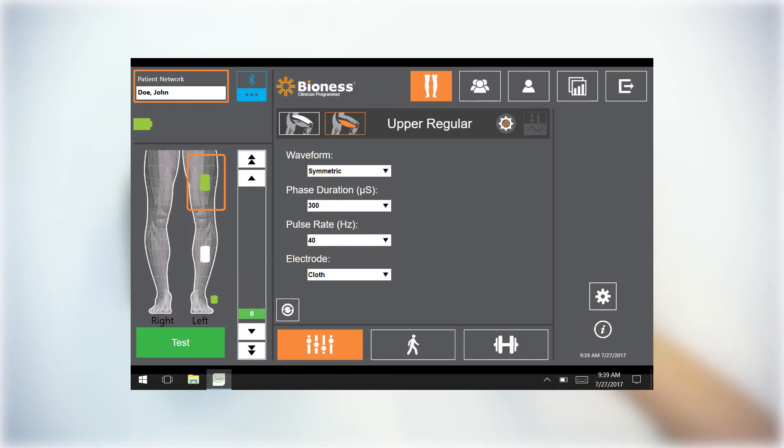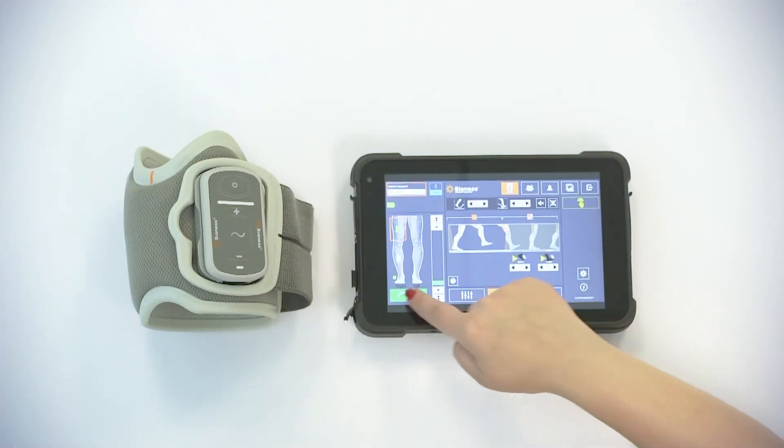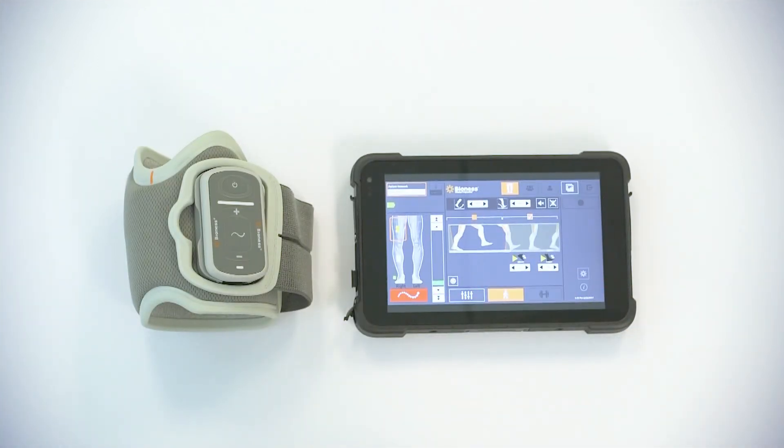Press and hold the lower cuff on the programmer until it turns white. Adjust thigh cuff gait settings as appropriate, then place into gait mode and you're all set.